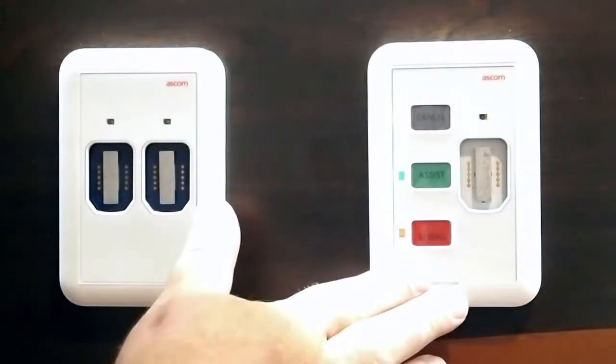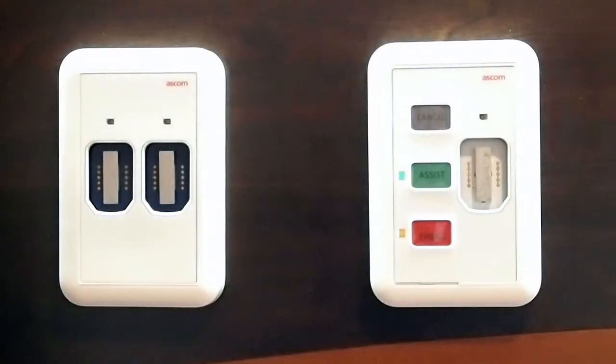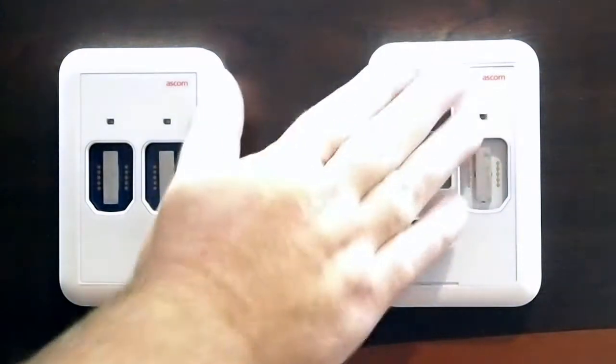These buttons are a sealed membrane so that we can sanitize the station. This allows us to help with your infection control. Not only is it a sealed surface, but we can clean it as well.